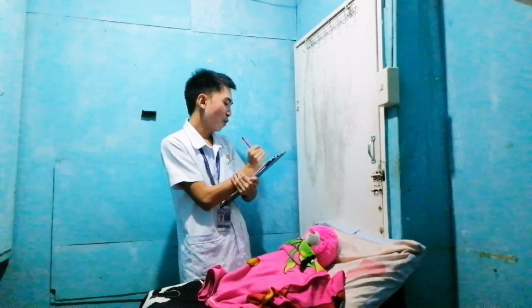So ma'am, let me introduce myself to you. I am Guadalquiver and I am your student nurse for today. So may I know your full name please? When is your birthday? How would you like me to call you? Okay, great. So ma'am Jenny, the procedure that I'll be doing is administering an intradermal medication. So intradermal medication is administered through your dermis, which is a layer of your skin. And also this medication will create a small wheal or sometimes called a bleb. So this wheal is a small raised area like a blister.